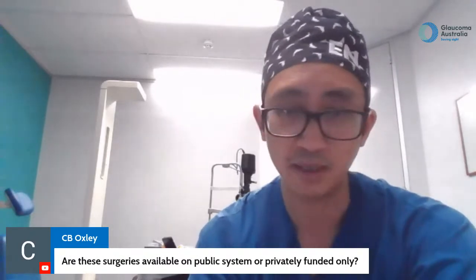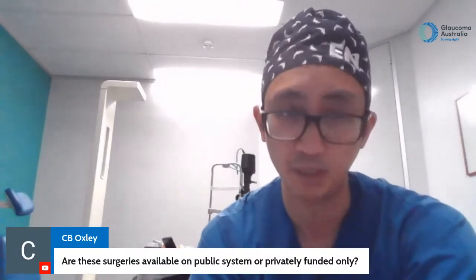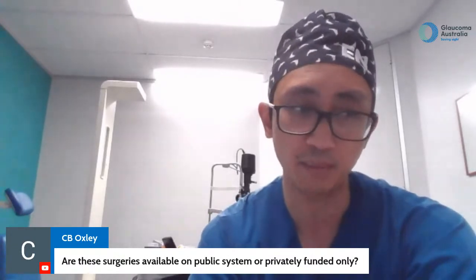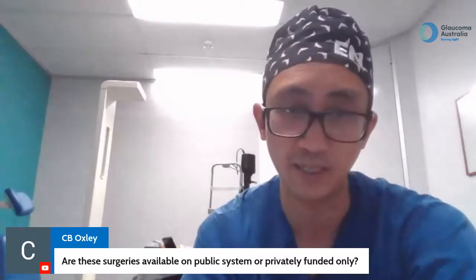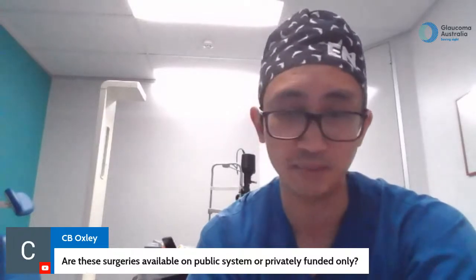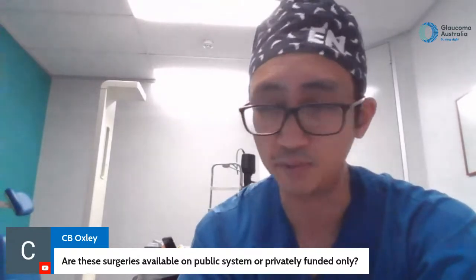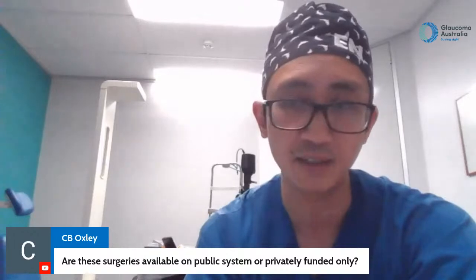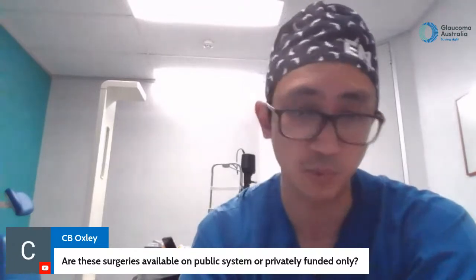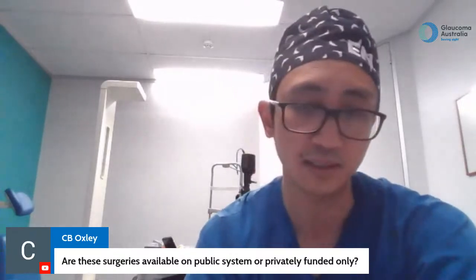Things like trabeculectomies, Baerveldt tubes and stuff, they're tried and tested. The government funds all those. You can have all those done in the public system for sure. The iStent at the moment is not currently funded through the public system because the pressure reduction is very low, and the government has probably looked at that and thought that the cost of the stent for the 2mm or 3mm reduction isn't worth the cost of them funding that, when realistically people could most likely achieve most of that by taking a drop of Xalatan once a day, which, most of the time, the government funds through the PBS as well. They've done a cost analysis and thought it's more effective to fund the drops than it is to have the iStent.